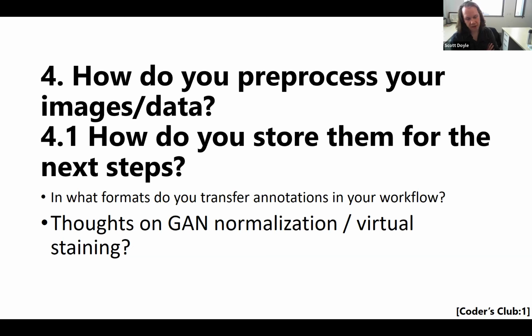Because what I've seen, and maybe this was just a bad experience, but I've seen papers, abstracts, presentations where they talk about using GAN to generate an infinite number of training sets, which is not possible. That's not a real thing. So my big thing is GANs are constrained by the variation that they're exposed to when you're training the GAN. You're not going to be able to create variability out of that sample size that's going to add to the kind of biological variability that you might see in terms of the expression.